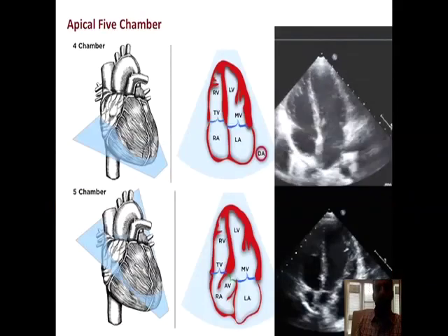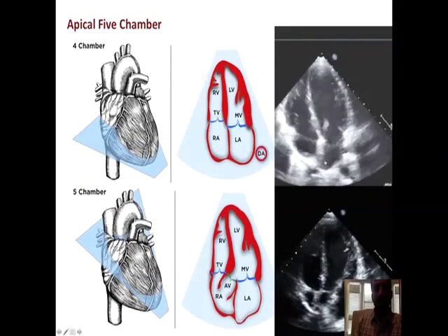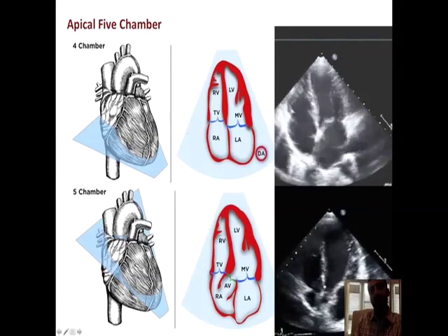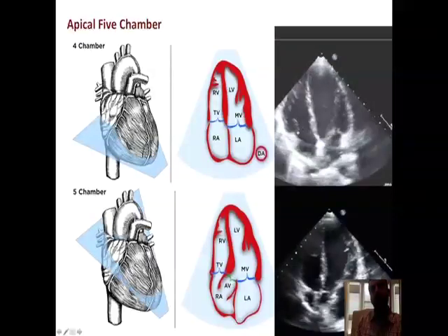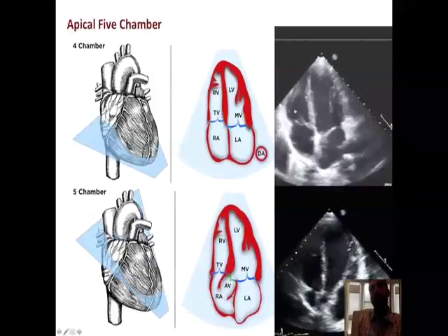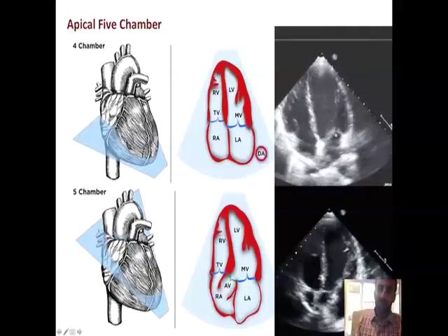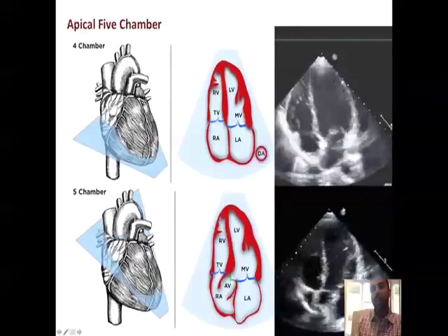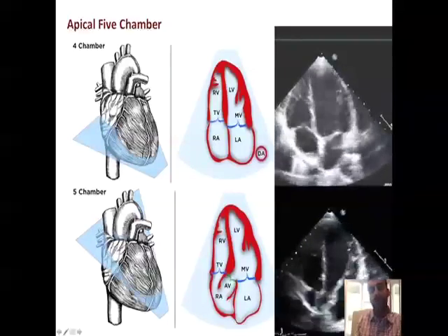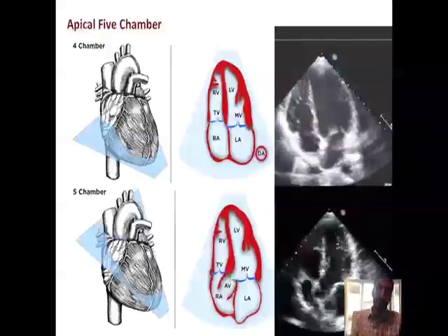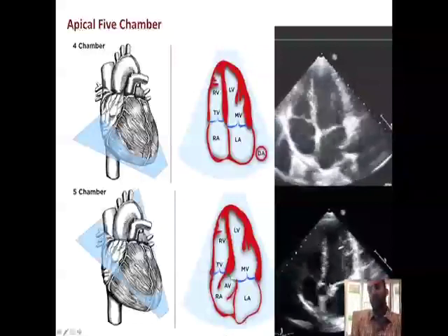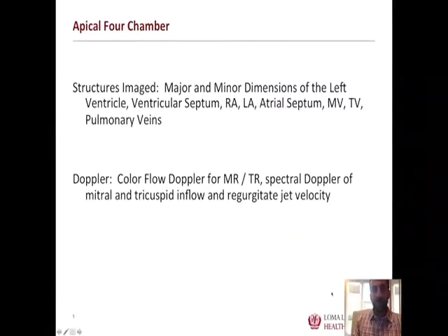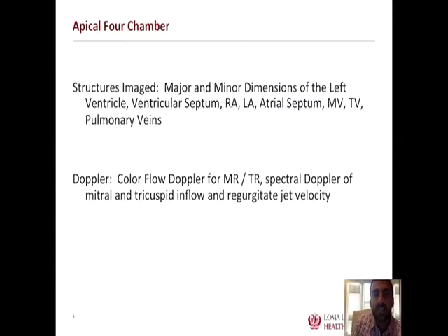The four-chamber view clearly identifies the tricuspid valve, right ventricle, left ventricle, and mitral valve. By having a more anterior cross section — lowering the angle of the ultrasound probe with the skin — you are able to insonate the left ventricular outflow tract and the aortic valve. This is the anatomy we assess for the apical four-chamber view.